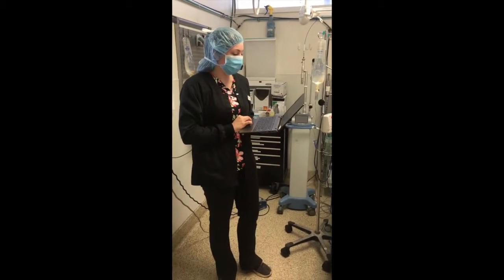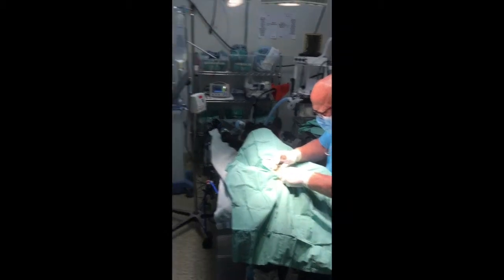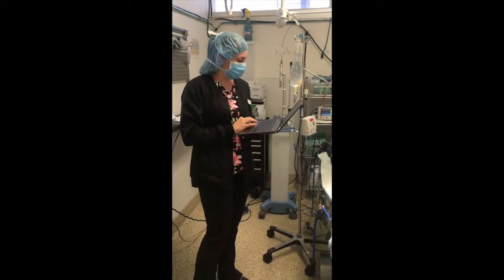Alright, so I have Jake here. He's a neuter for today. Dr. Stoner's performing his neuter. I'm just going to go ahead and take some vital signs and readings for Mr. Jake here.